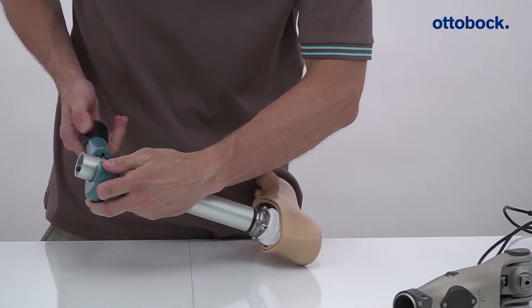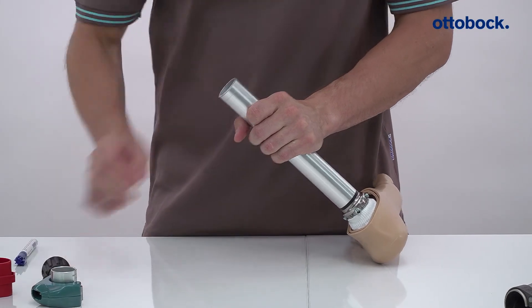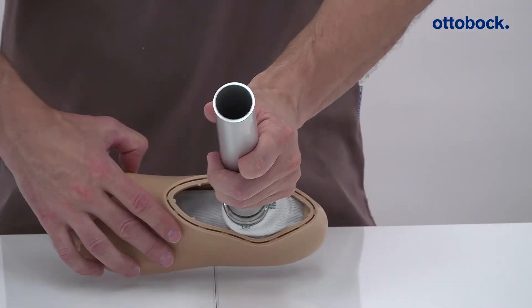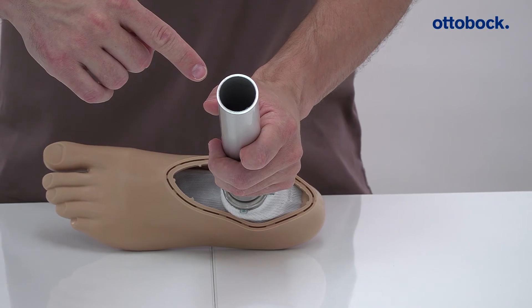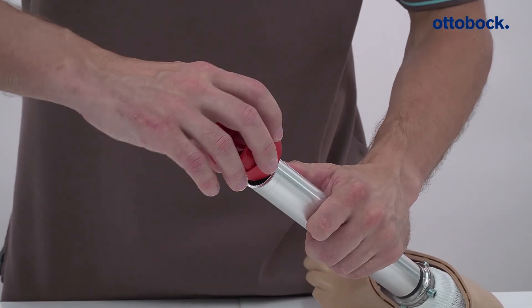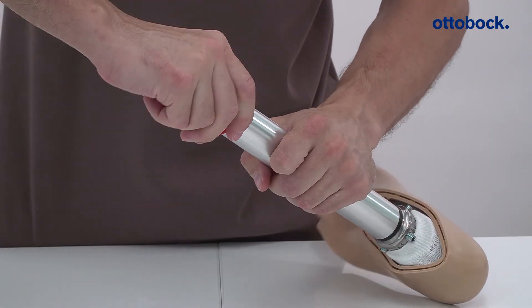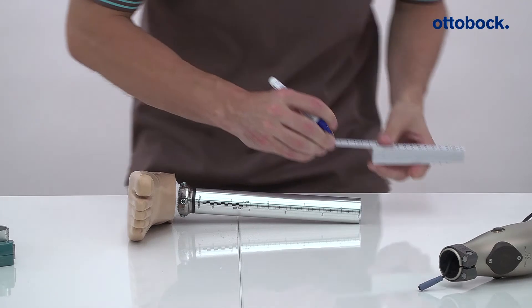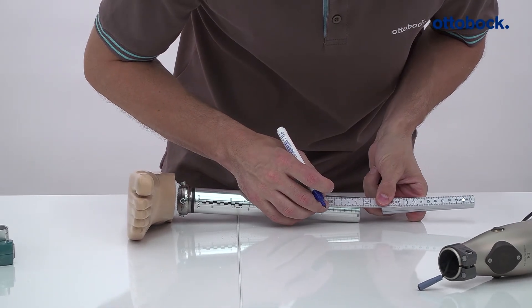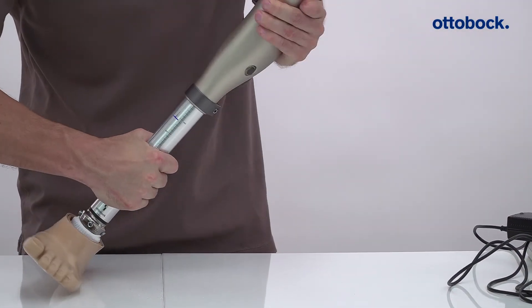The excess length of the tube is then trimmed using the tube cutter, and the inner and outer edges are deburred. Mark the 55 mm insertion length and reassemble the components.